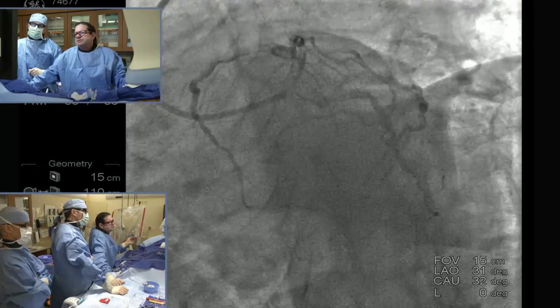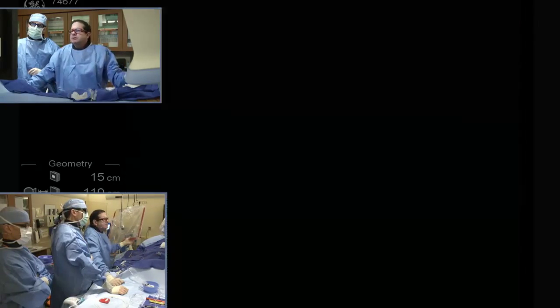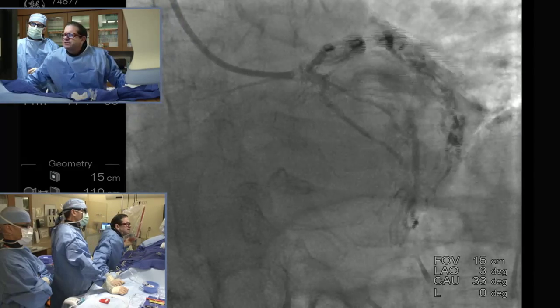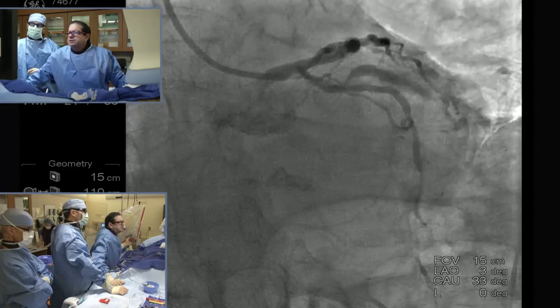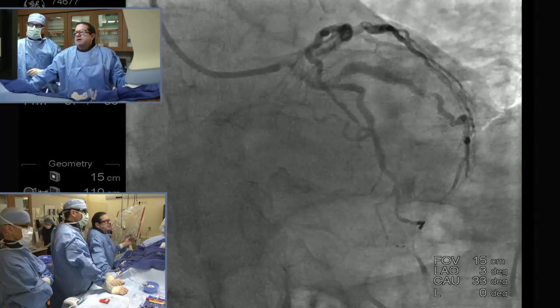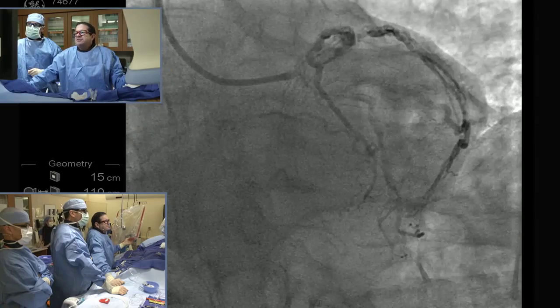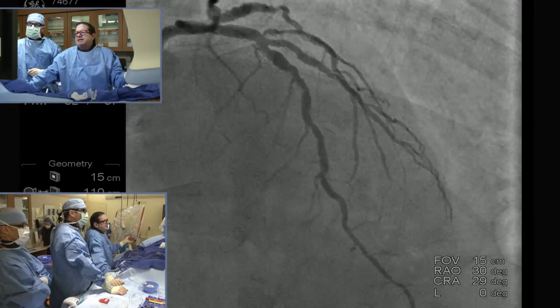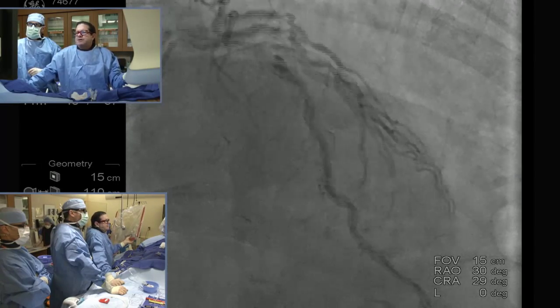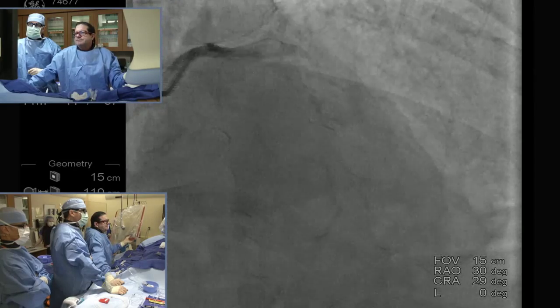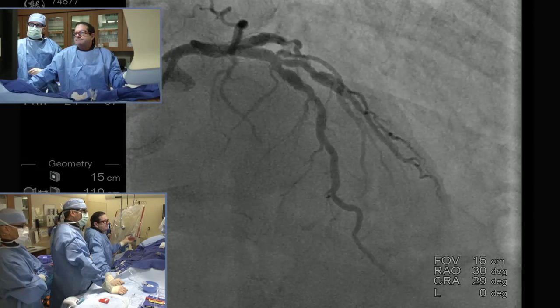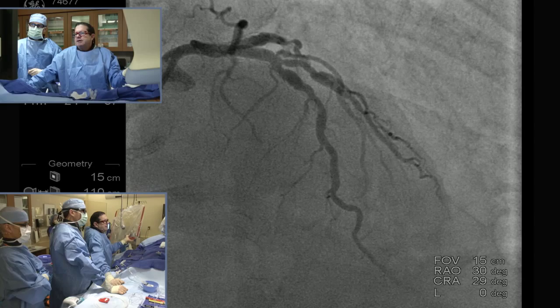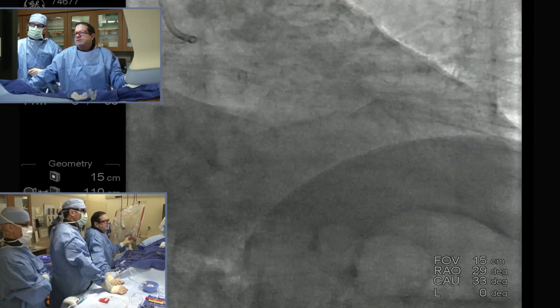And then this is the circ, which doesn't look that bad. You can see the stent in the circ, which is just beyond the bifurcation — so that's actually already stented for us, which is kind of nice. Look at the LAD — that looks like it could use an FFR, right? The mid-LAD. Maybe we'll add that to the case.